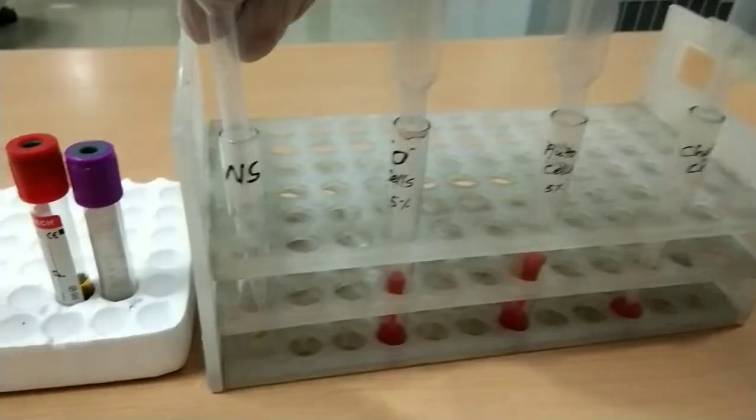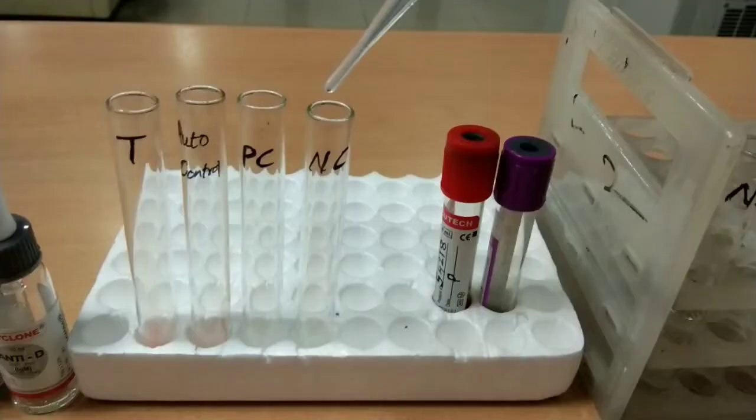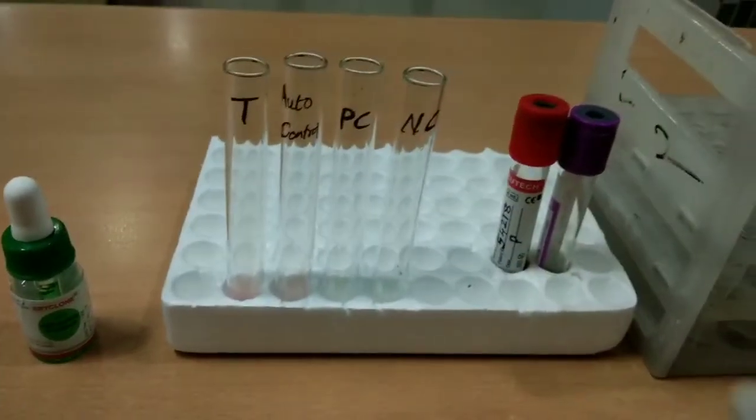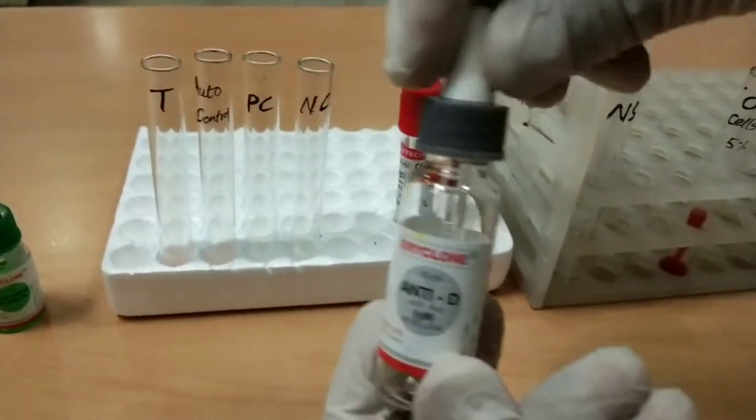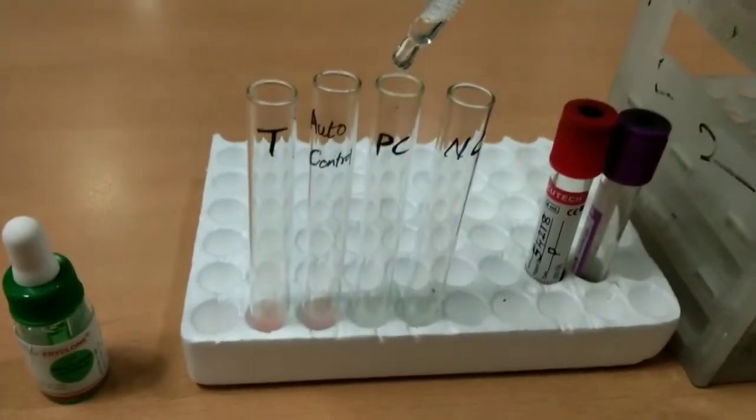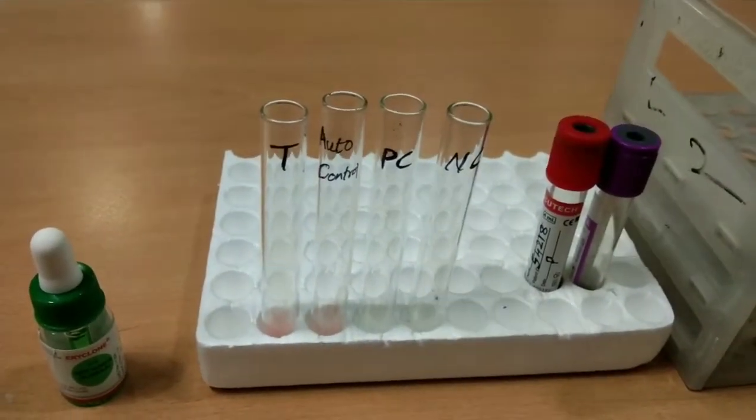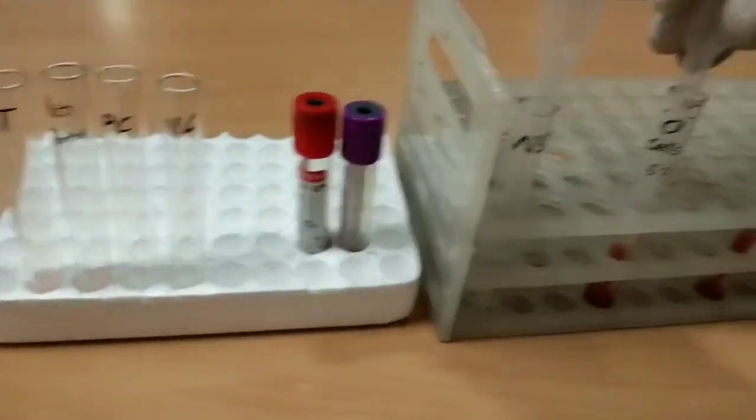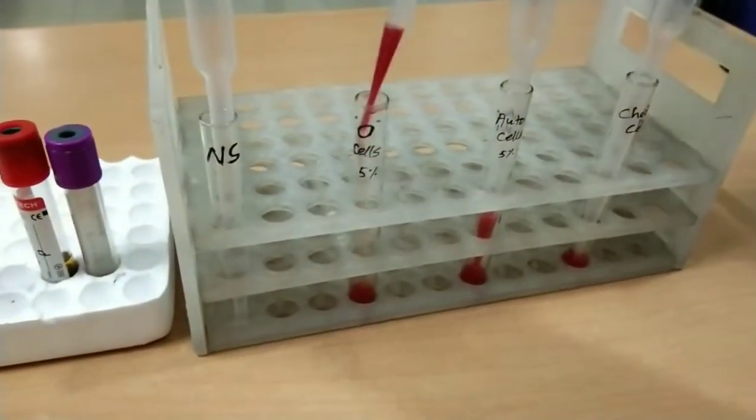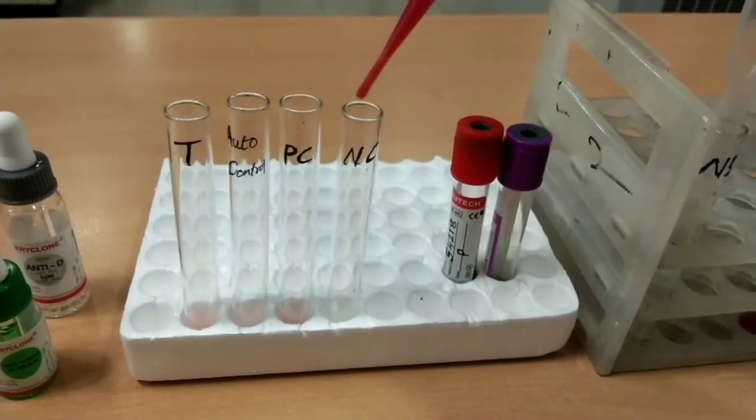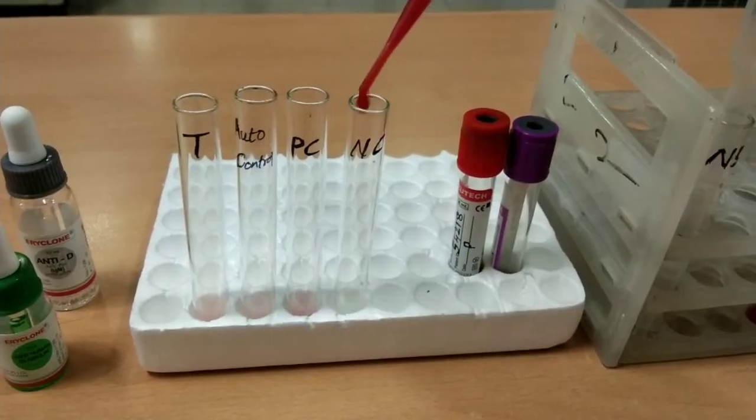Then add two drops of normal saline into the negative control tube and two drops of anti-D antisera into the positive control tube. Add two drops of O-positive cells into the positive control tube and one drop of O-positive cells into the negative control tube.